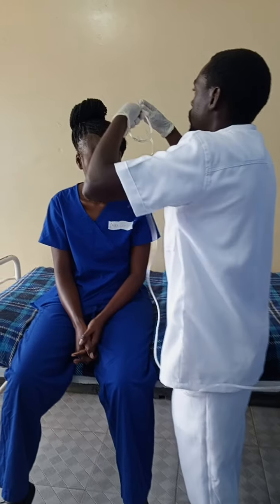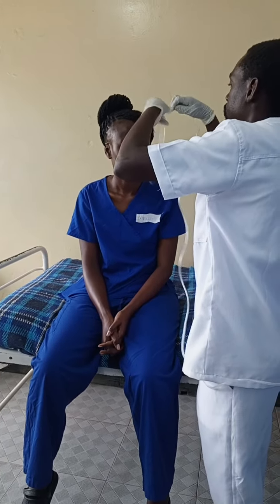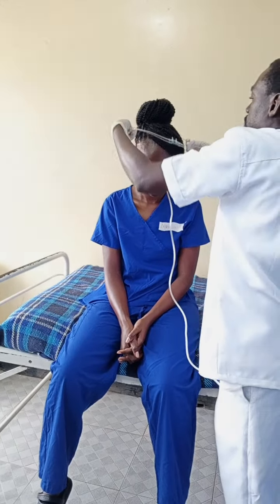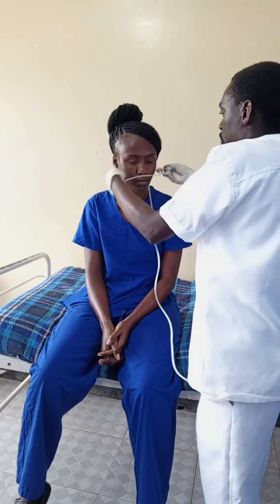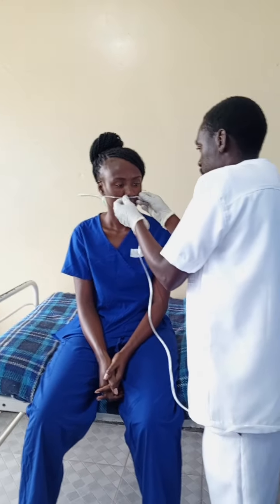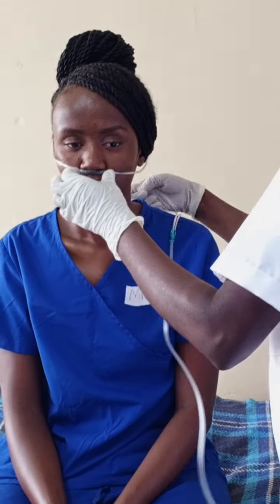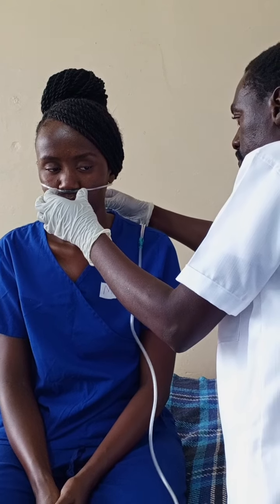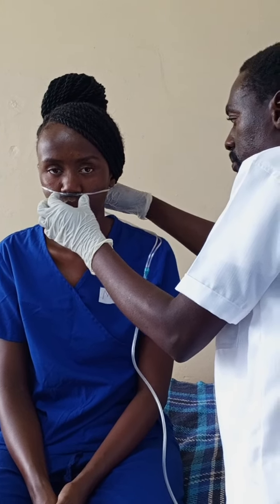Just be comfortable. So that's the oxygen that we have administered to the patient. Madam, how are you feeling now? Are you feeling much better? The patient has confirmed that she is feeling much better.